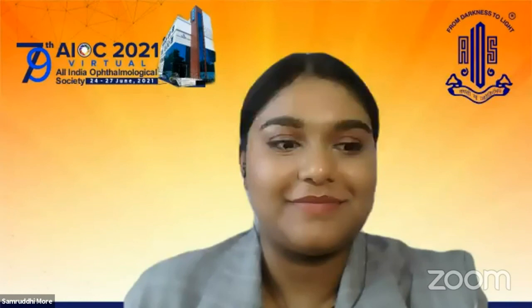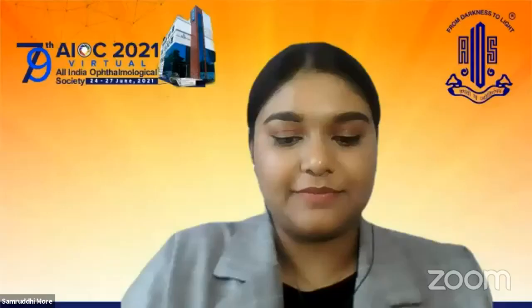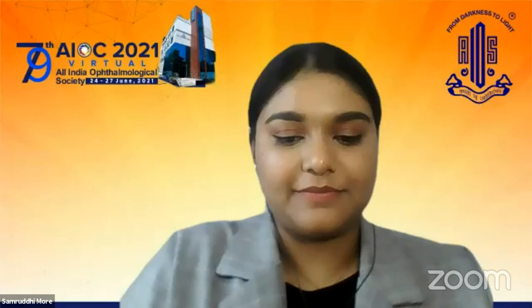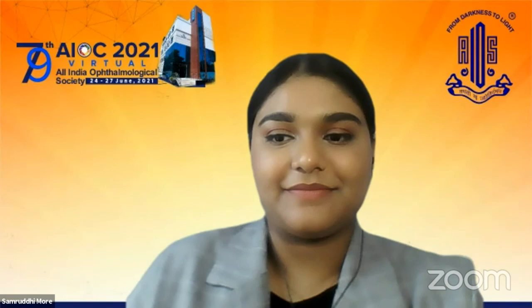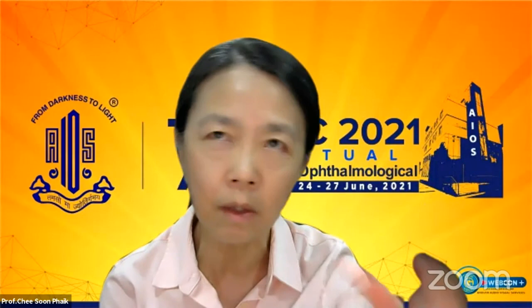Thank you. I have one question for Dr. Chi. How do you manage the retina examination and other things when you implant the artificial iris that you've shown? Because I was exactly going to ask the same question. Okay, so it's been published that you can even do a retinal surgery through that 3.5 mm pupil. I don't have problems checking the retina. If you use even a 30 diopter lens, you can see right to the periphery.